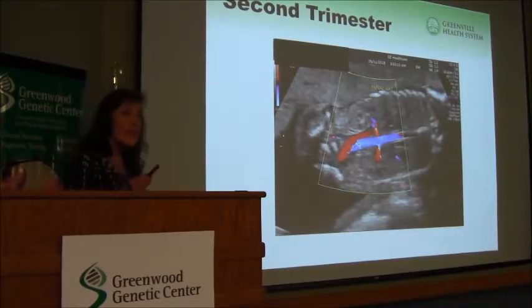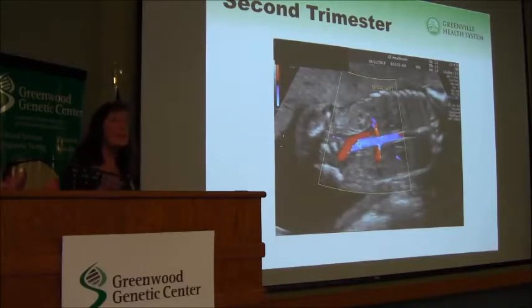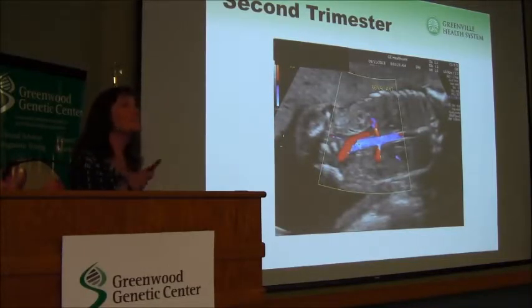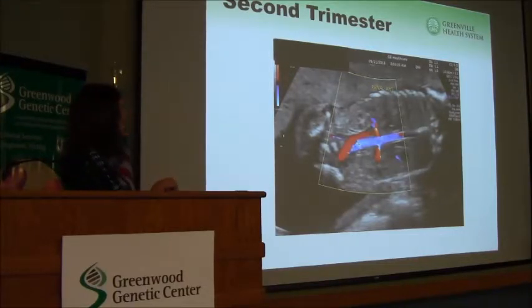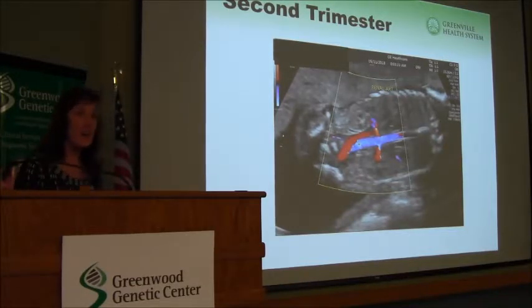All right, I did take offense at one thing you said, Dr. Skinner. We are really good at making sure both kidneys are there. But he's right. In the last 5 years, we've gotten much better at interrogating the fact that both kidneys are there. These are the renal arteries, and we make our sonographers get pictures of the renal arteries on both sides to prove that there are kidneys.